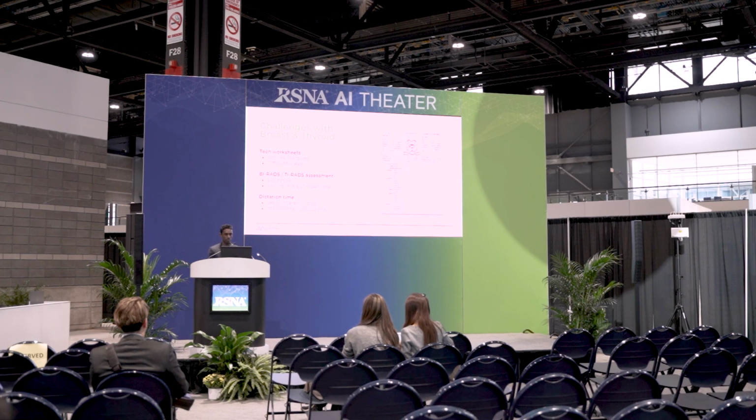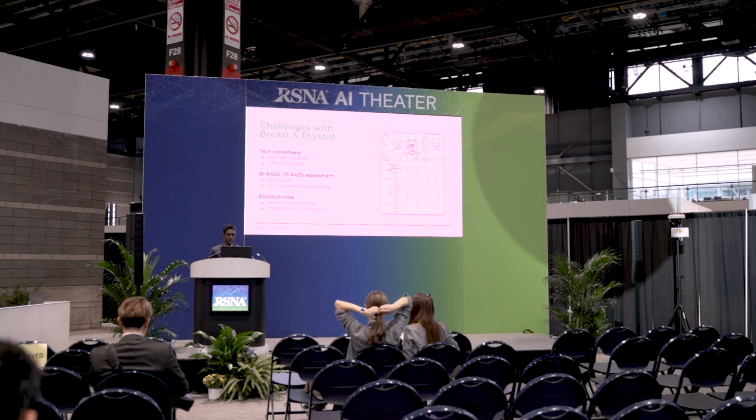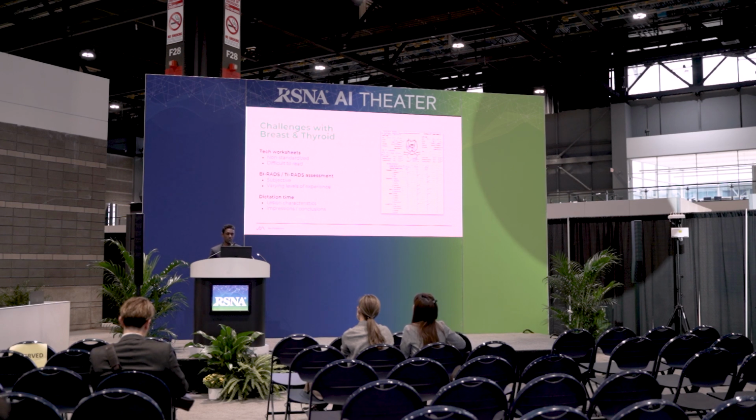So in terms of why we decided to focus on breast and thyroid in particular, these are some studies that when we talk to clinicians we consistently hear are time-consuming and complicated. And so part of that is due to the tech worksheets that are produced. They can often be quite difficult to read, especially if they're handwritten on paper, and they're often non-standardized. BI-RADS and TIRADS themselves can be subjective, and clinicians have different levels of experience when it comes to using those descriptors. And then even technicians themselves have different levels of expertise when it comes to capturing images of thyroid and breast scans. And this leads to a potentially significant amount of dictation time for the radiologist. And it's this dictation time we think that we can really bring down with our solution.